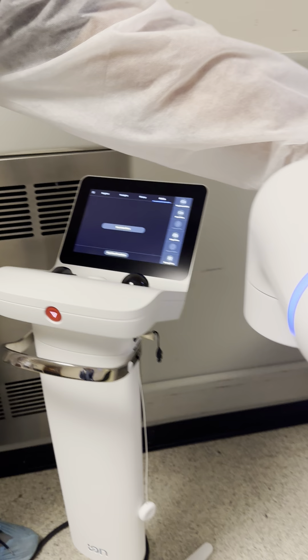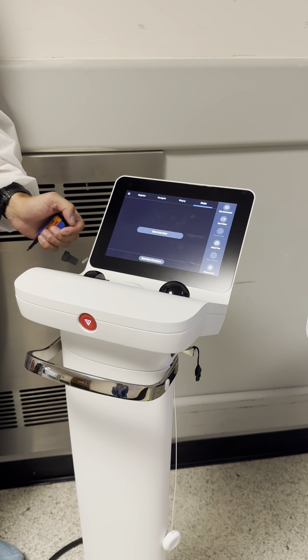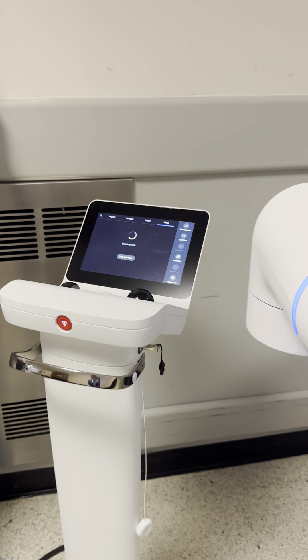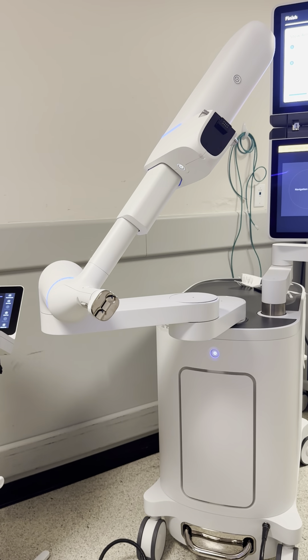If the case is now done, you can click Auto Stow. If there's a new case, you can click Start New Procedure. We'll click Auto Stow and pretend there's no longer a case. Now it's going to put the arm to where it wants to be at rest for when you turn the machine off.